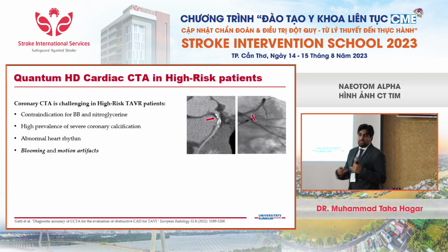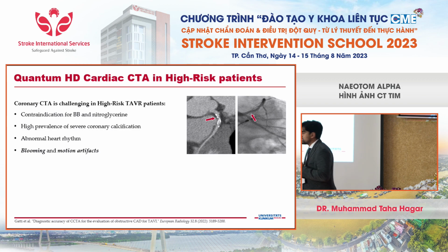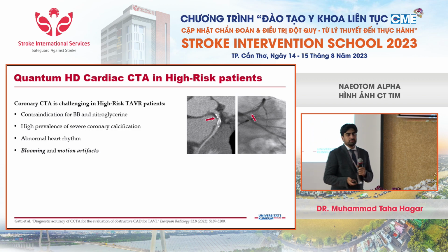With conventional CT imaging, there's this dogma or known limitation where you overestimate stenosis when you have a high calcified plaque burden, as seen on this image, where you would suspect severe stenosis, but then on the angiogram you see only mild wall irregularities.